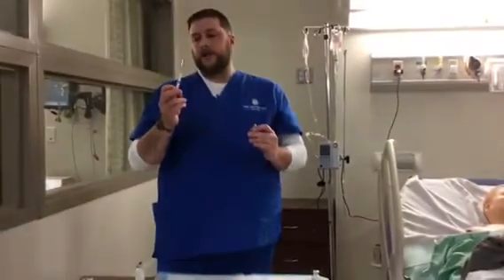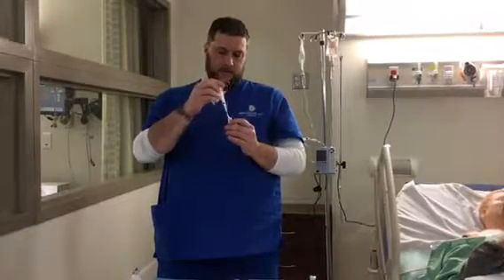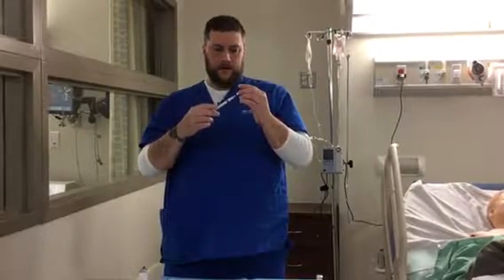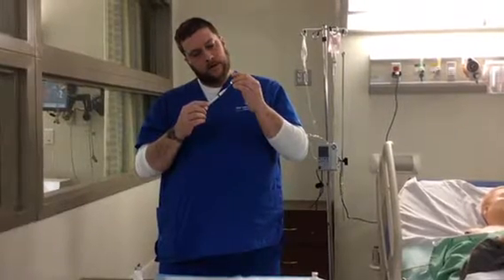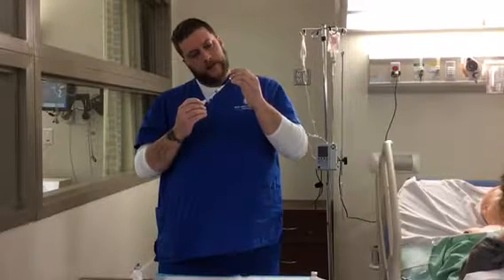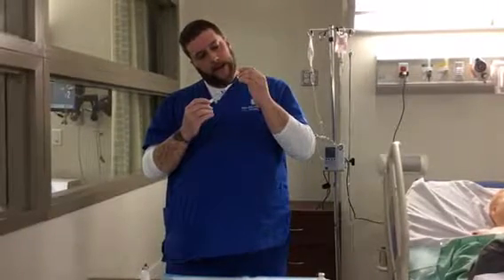Now, using a syringe with a filtered needle, at this point, you're going to insert the needle and slowly turn. You're going to withdraw all the medication, being careful to move the needle down as you go.